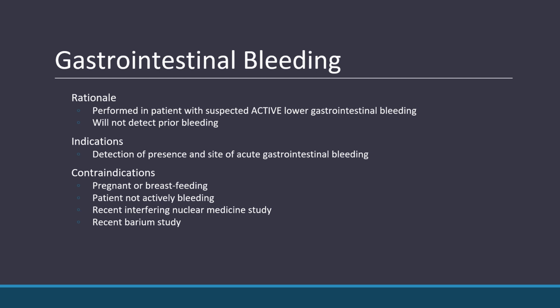Indications are just for the detection of the presence of GI bleeding and the site of acute gastrointestinal bleeding. So it helps detect and localize it.